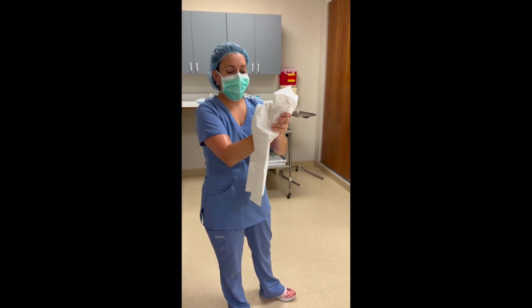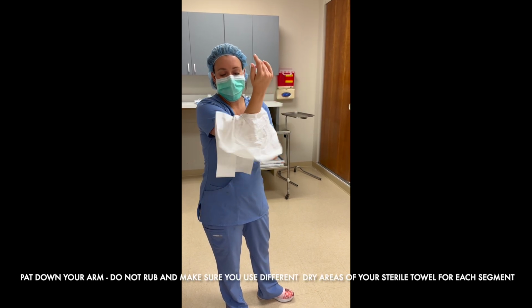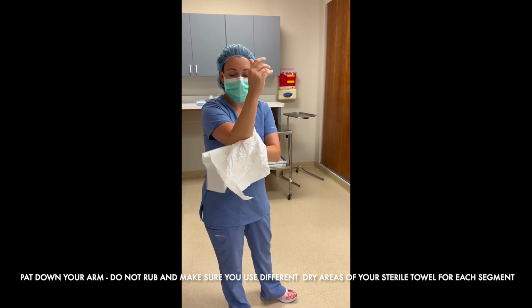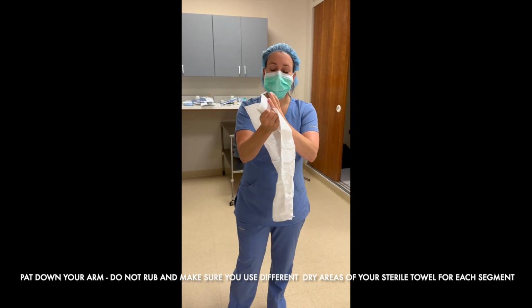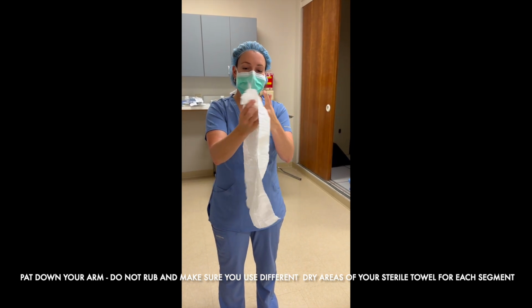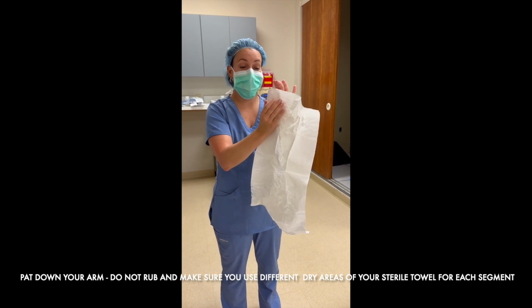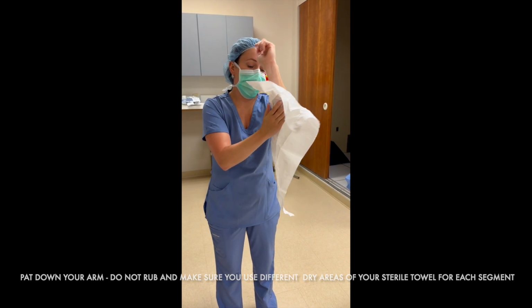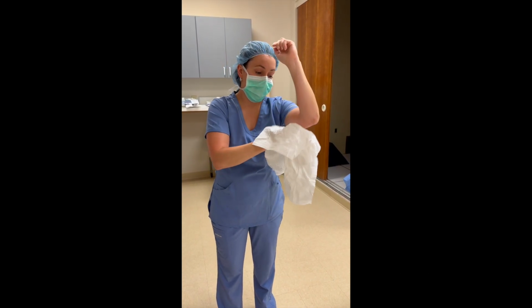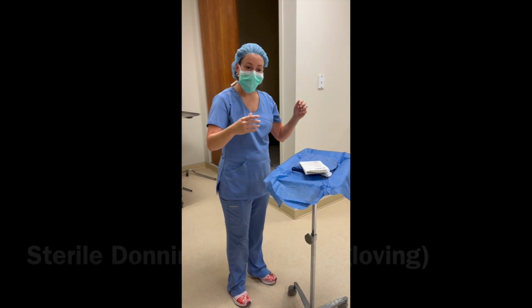I'm going to pat this, then I'm going to shift them, pat this side of my arm, and see how I'm slowly moving down the towel, okay? Now I'm going to switch this over to this side. I'm going to do the same thing, just patting each finger, trying my best to use a different area of my towel, and just patting all the way down. This is trash. Now I'm ready to put on my sterile gown, okay?